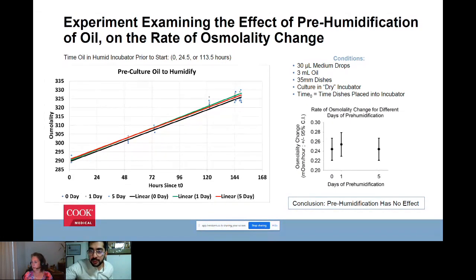If we use media from one company and oil from another company, does that make a difference? Of course, every company is going to say yes, it does. Look, we did a fair experiment by using 9 different oils from 5 different companies. It depends on you. It's not going to make a change. It depends on your own research on the oil and asking the company representative or the clinical specialist for more data on the oil. But in the incubator per se, it's like saying, do I need to use a certain media for a certain incubator? Of course, I'm going to say yes, because we have evaluated our media with our incubator.